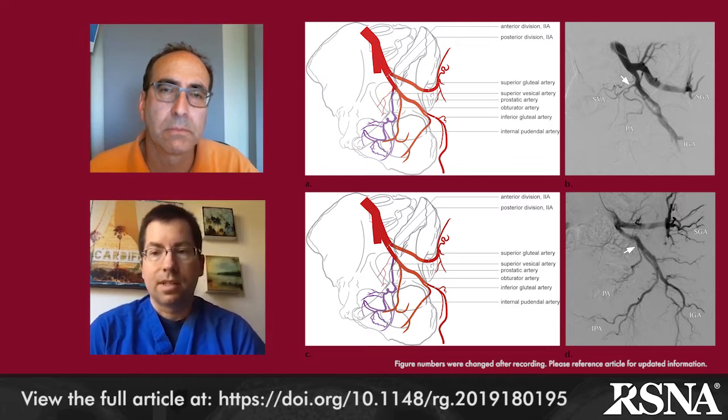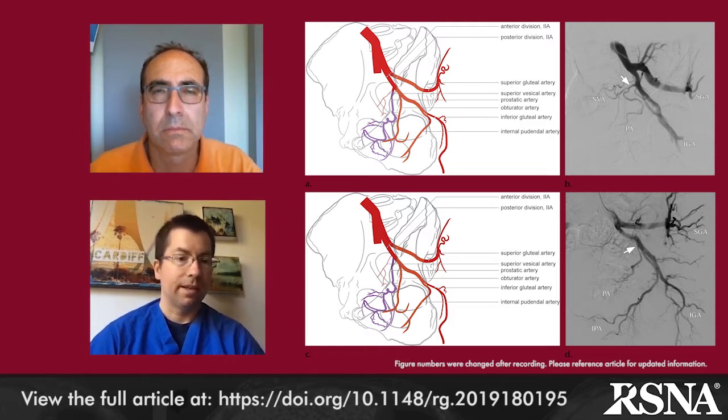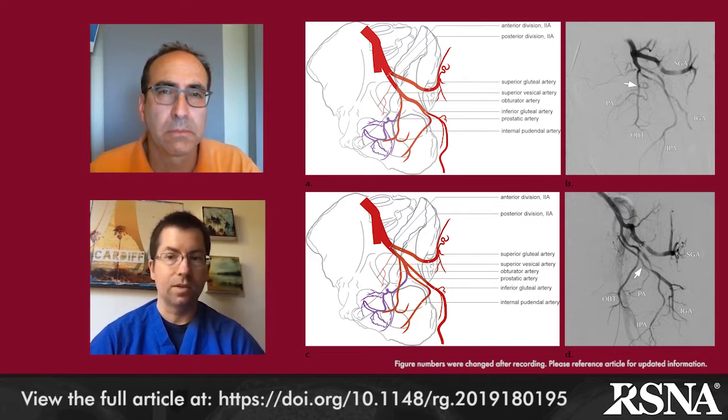The prostatic arteries themselves give off inferior vesical arteries and then seminal vesicle arteries as they course towards the prostate. They then typically terminate in two pedicles. There's a superior pedicle, which is also called the anterolateral pedicle based on the CT appearance. This supplies the central gland and is the primary target for embolization. The inferior pedicle, also called the posterolateral pedicle, supplies the periphery and the apex of the gland. Both divisions may supply the BPH nodules and should be embolized if it's determined to be safe.